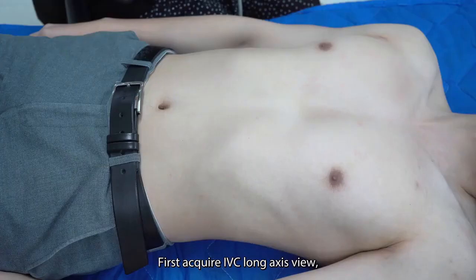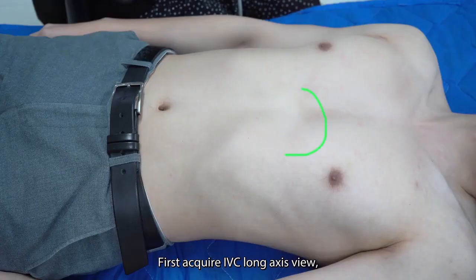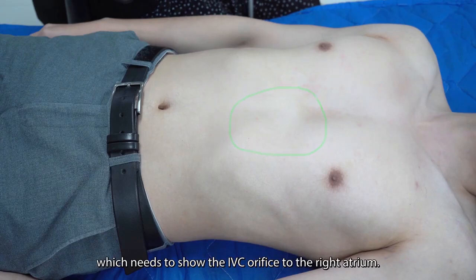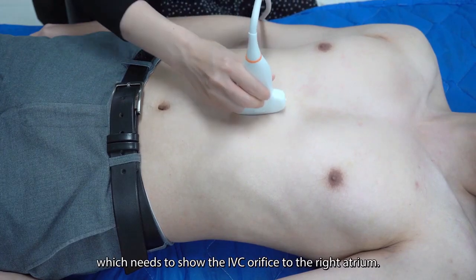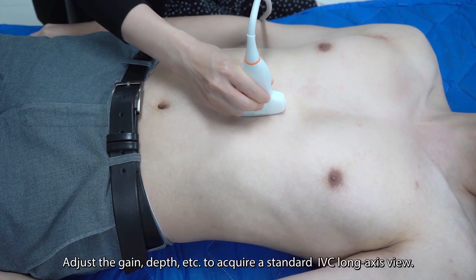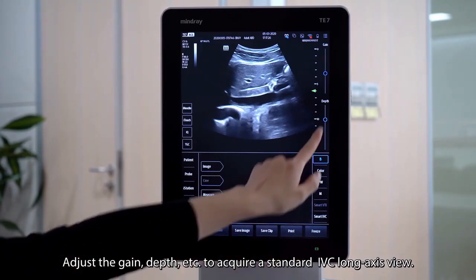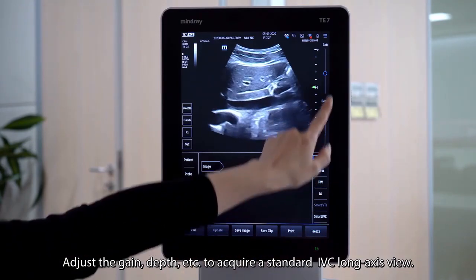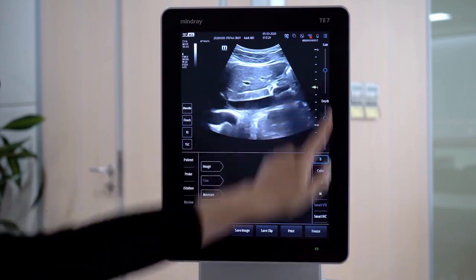First, acquire the IVC long axis view, which needs to show the IVC orifice to the right atrium. Adjust the gain, depth, etc., to acquire a standard IVC long axis view.